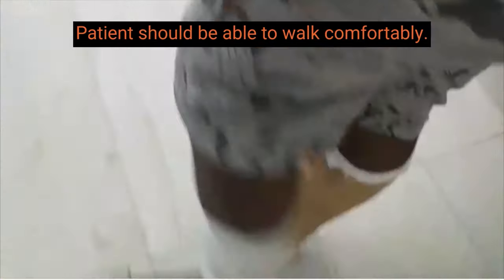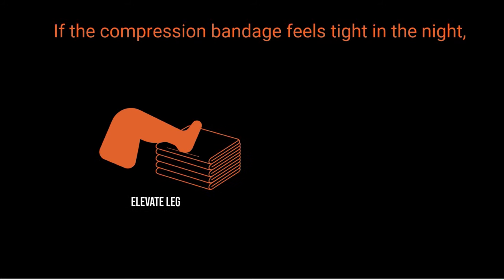If correctly applied, the system should feel tight and you should be able to walk normally. If the compression bandage feels tight in bed at night, getting up for a short walk will usually help.